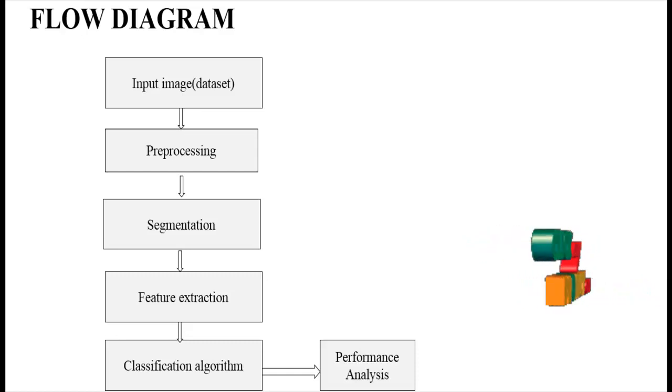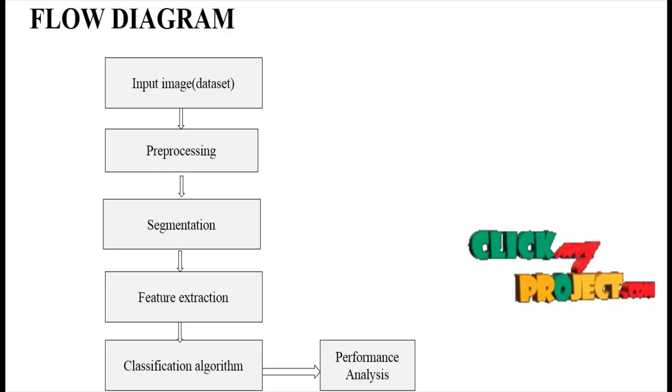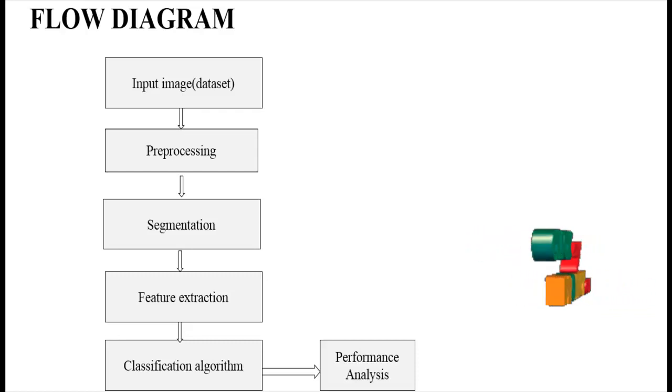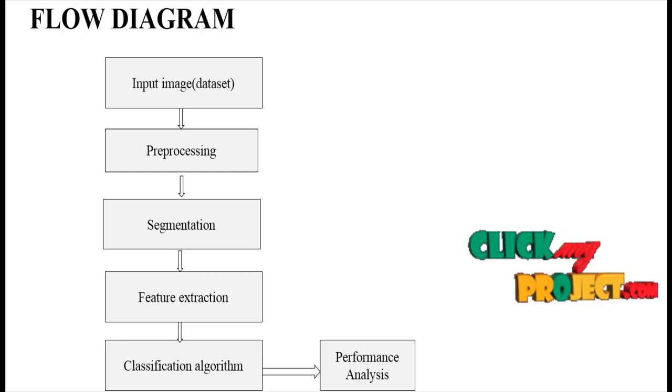Finally, the experimental result shows the accuracy as well as the affected region of our input image, and the training and validation accuracy will be displayed.